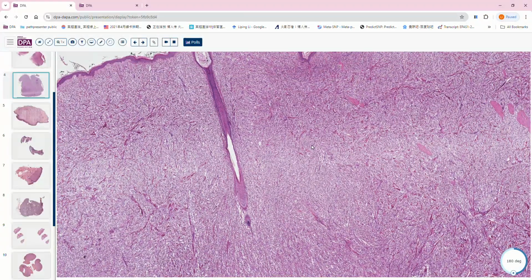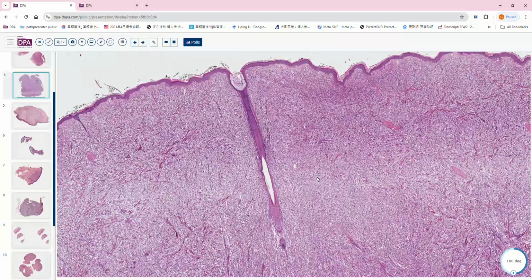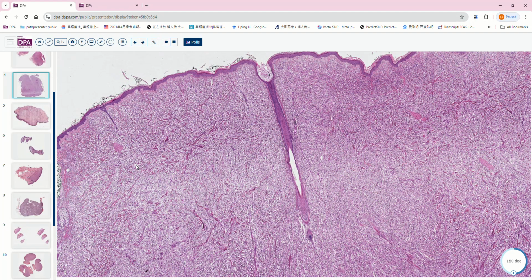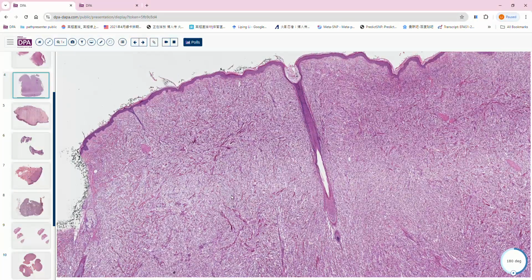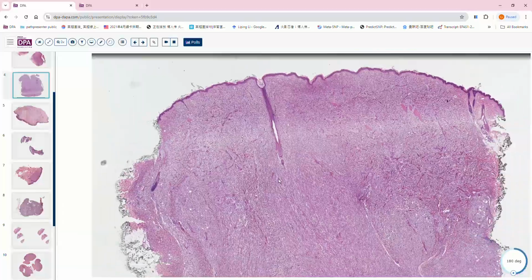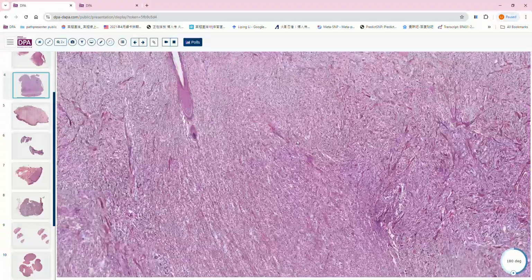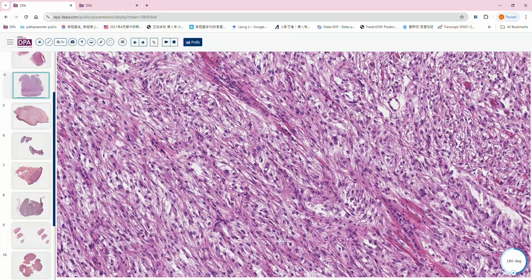And then in the internal organ, PEComa, we also call this AML, right? Angiomyolipoma. But for the skin, we just do not see the feature of any AML. And they are not usually related to TFE3, because in some internal organ AML, they are related to TFE3, but this one is usually not. The prognosis is really good and it is really rare. So I think in superficial skin, when you see this clear cytoplasm, looking like renal cell carcinoma, I think it's just renal cell carcinoma, not cutaneous PEComa.